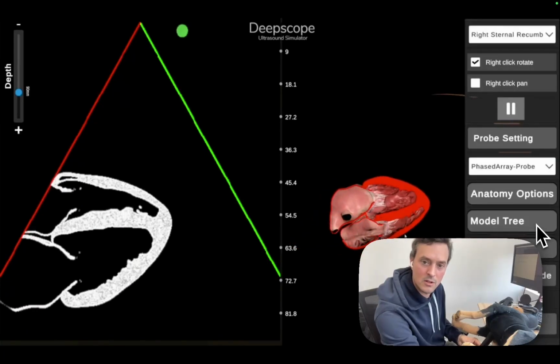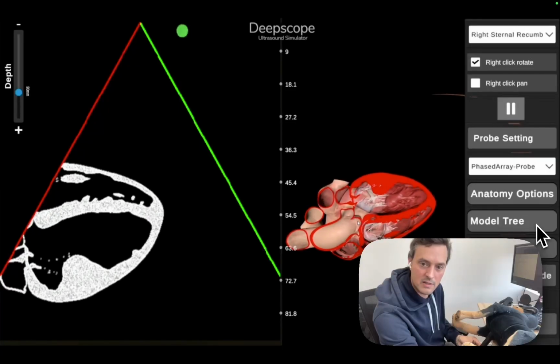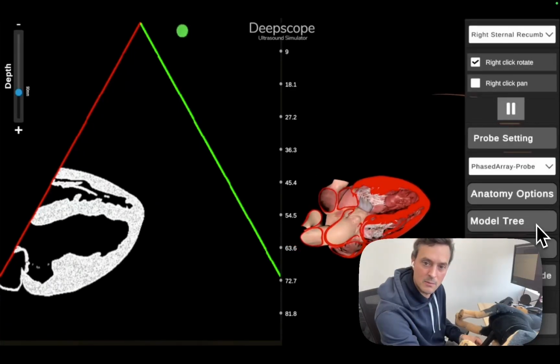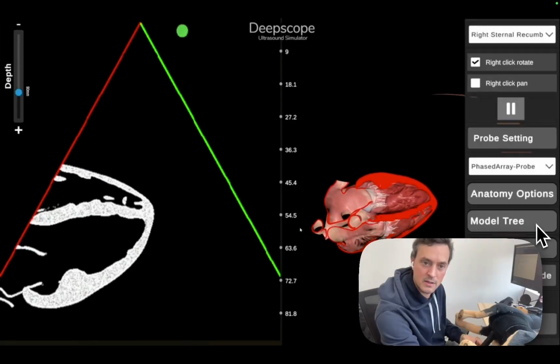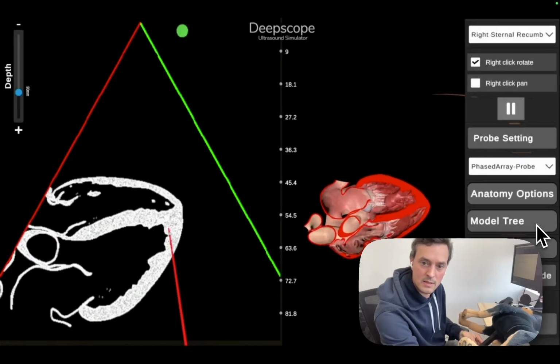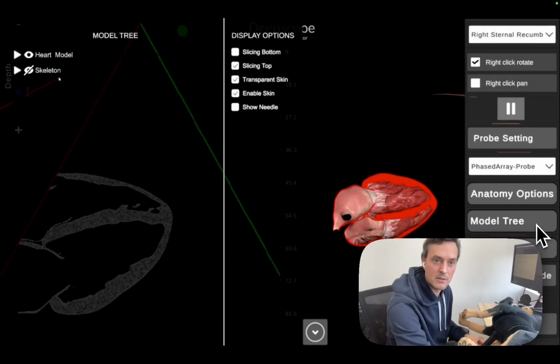There we go. So we can show them how you get to it by rotating, which brings in the aortic valve here. So we rotate 15 degrees and we get the aortic valve coming in, and that's why it's going to be a 5-chamber view at that point. You can be more granular about it as well.